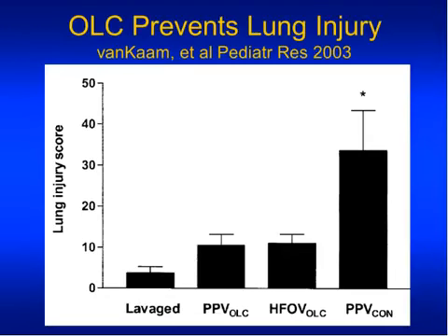But that actually doesn't happen, and I guess I don't really have time to go through this, but I will point out that we proved on the bench that this conventional physiology isn't exactly right, and that we were actually able to wash out CO2 out of the lung with tidal volumes even below the measured dead space, and that the concept of dead space isn't totally fictitious, but it isn't totally real either, because there aren't little boxes that move in and out, and there's in fact some streaming of fresh gas through, that penetrates through the dead space, somewhat like in high-frequency ventilation. So that's just to give you a little tidbit, but time doesn't quite permit for that.